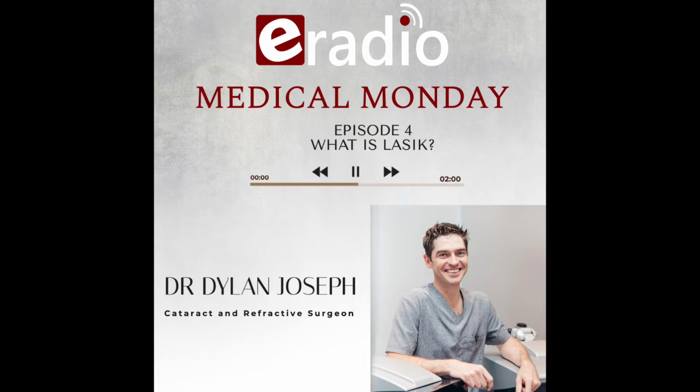Wow. So I know this may sound a little bit graphic, but when you're talking about LASIK, what is LASIK exactly? How do we do this? So the cornea, which is that clear dome or the outside layer of the eye, is exceptionally thin. It's 0.5 millimeter thick, 500 microns. So that's all that we have to deal with. So what we do on the surface of this cornea is we create an ultra-thin flap. So imagine taking an orange peeler and actually peeling off the skin of an orange, so that you can see the exposed underlying fruit.